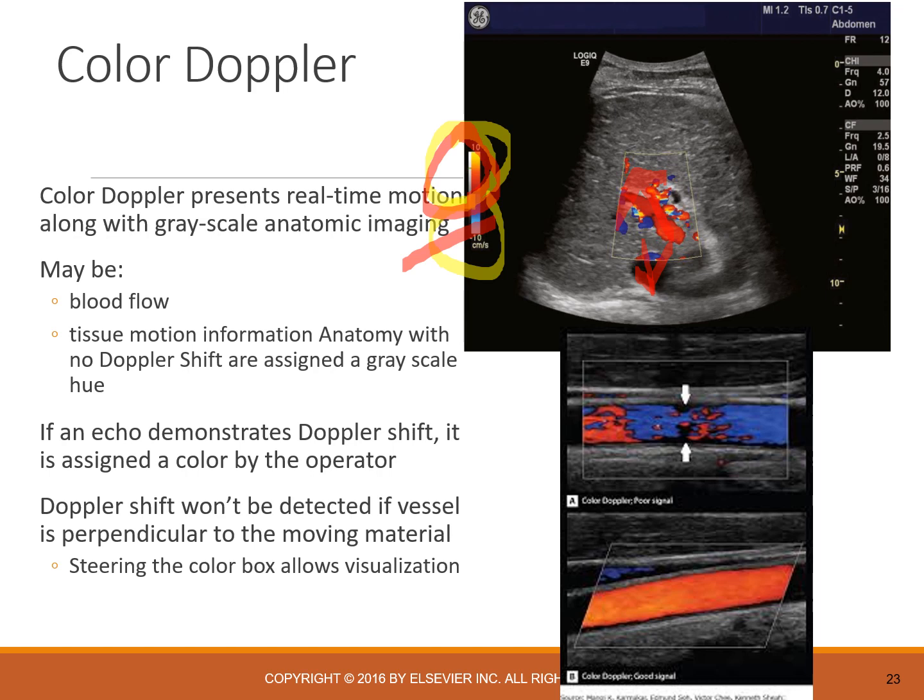It's just important that you're aware as the operator that you can do that. The machine has no way to determine something's arterial or venous. So it's a misconception to believe that all arterial is red and all venous is blue. Basically, we have to make the color scale correlate to the red and blue that we want to see on our image.